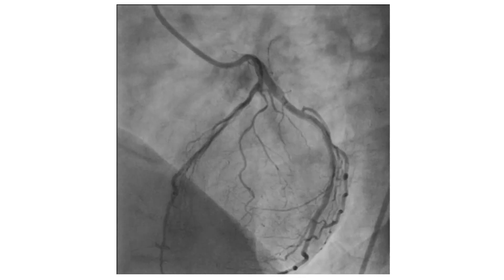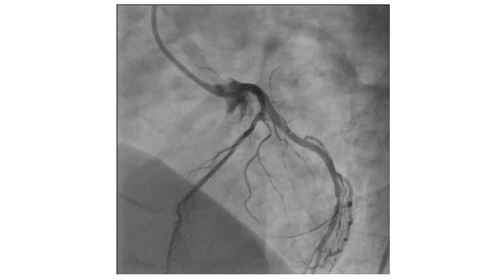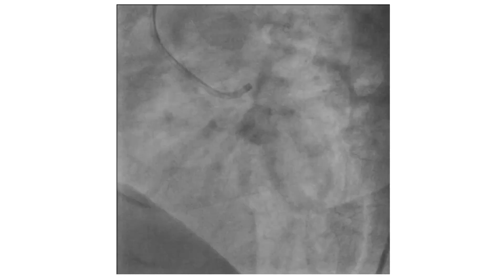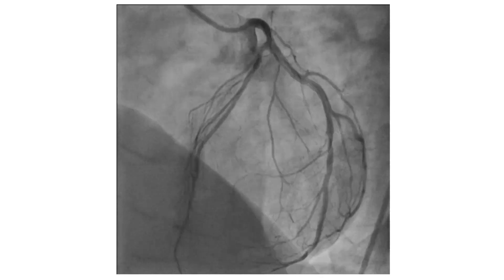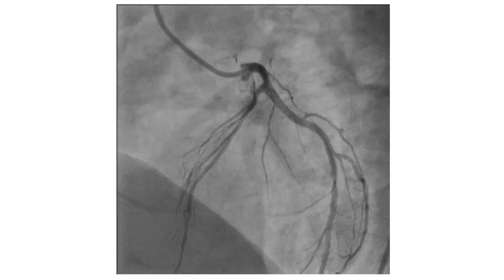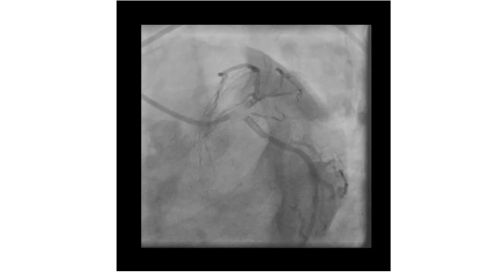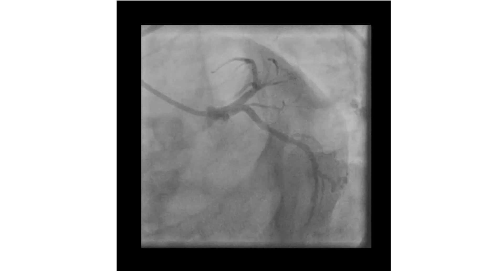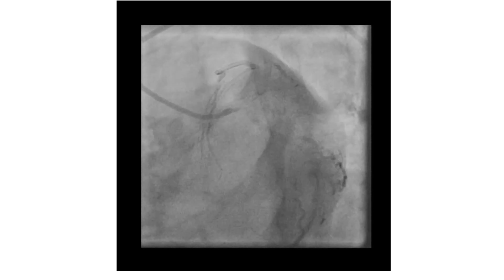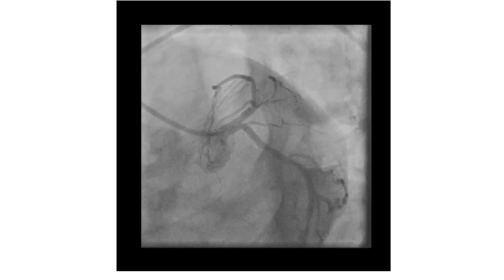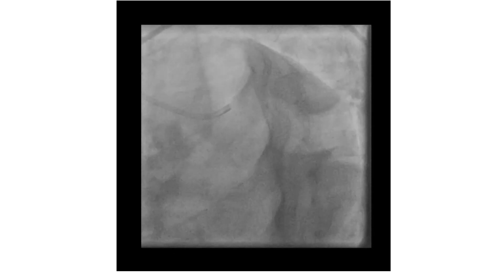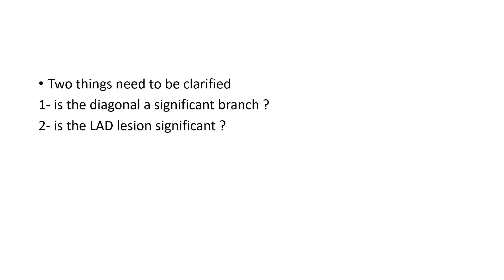This is an LAO cranial view. It shows the diagonal to be a long artery but with a small caliber. This is a spider view. The first diagonal has a critical lesion and the LAD lesion is still not clarified. So there are two things that need to be clarified: first, whether the diagonal is a significant branch, and second, to assess the significance of the LAD lesion.